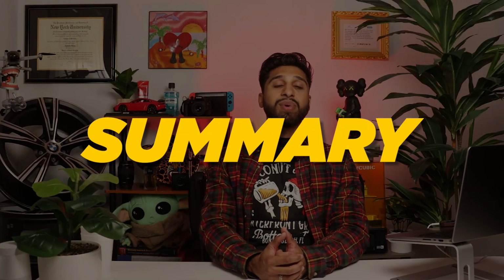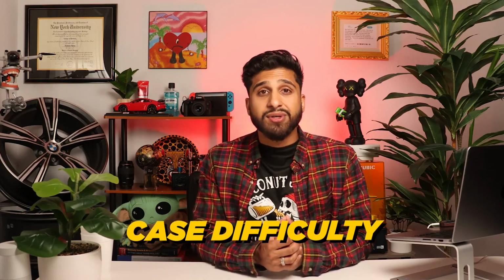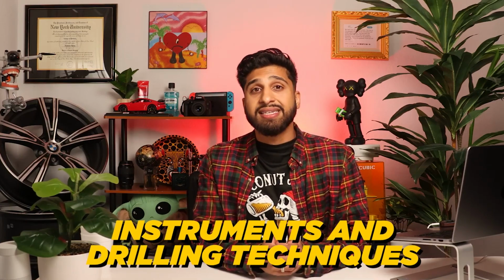So in summary, we discussed a challenging surgical extraction involving a root canal treated molar, assessing radiographs for case difficulty, the instruments and drilling techniques used, proper flap design, graft and membrane placement, suture techniques, and how to correct mistakes when viewed through a specialist perspective. I'm sure that there are individuals out there charging a ton of money to recent graduates drowning in debt just to learn the level of surgical technique I showed you today.